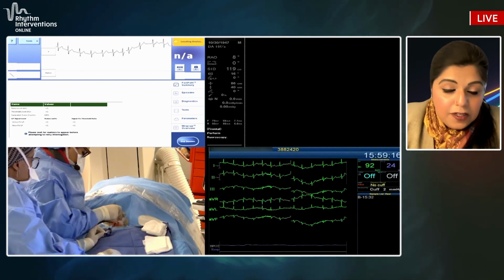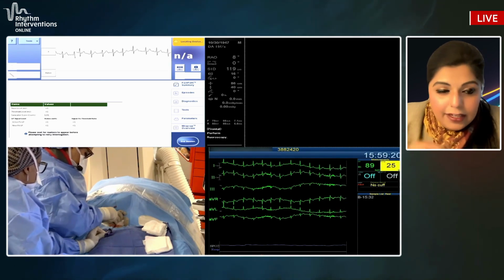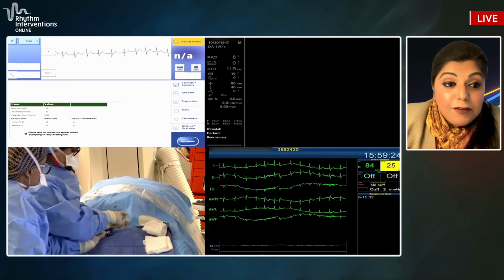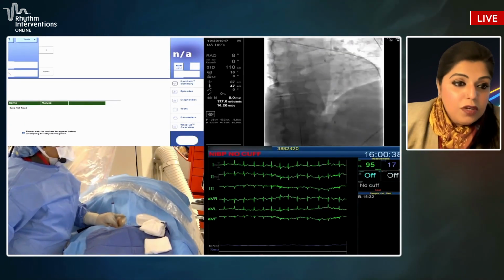He also has significant difficulties with mobility, and has difficulty following instructions. So a great patient that does not have to follow instructions with the transvenous lead and shoulder restrictions and whatnot.